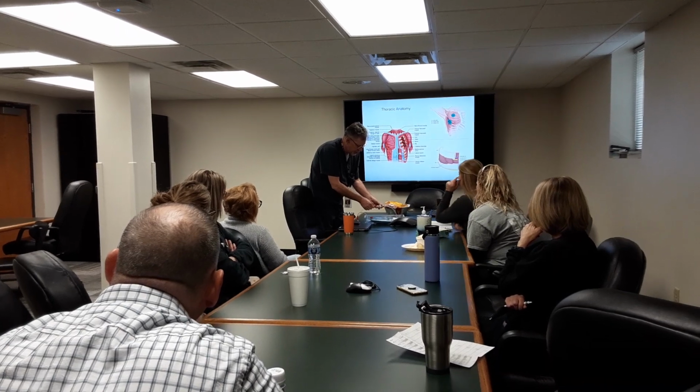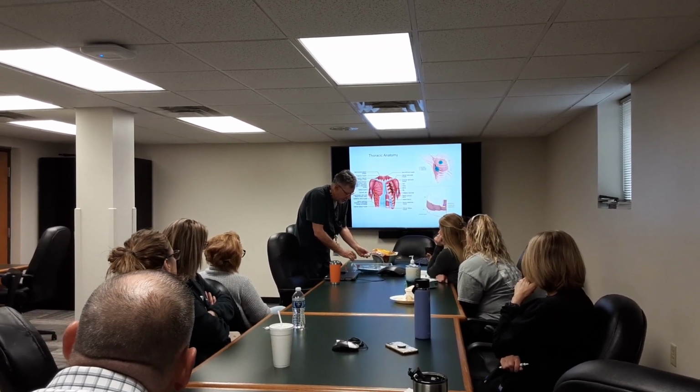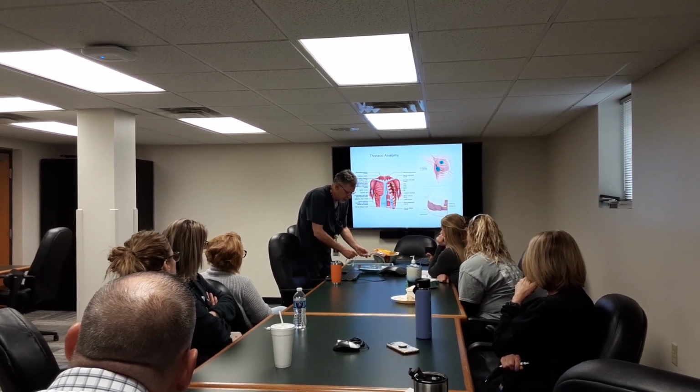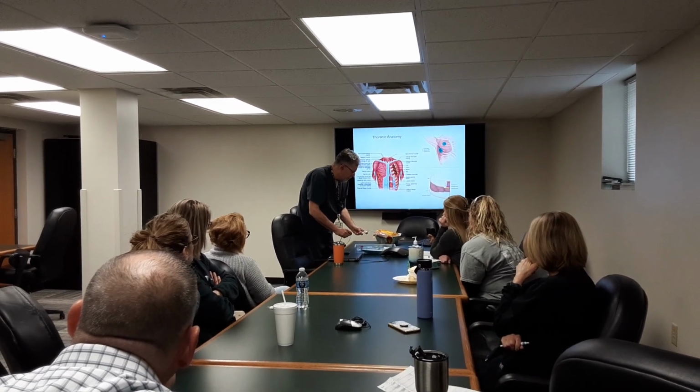So that's another mistake people make. This is the off position. That means this is on. So the wire will just pass right through that valve. So we're going to advance this all the way, and it'll come back out the other side.